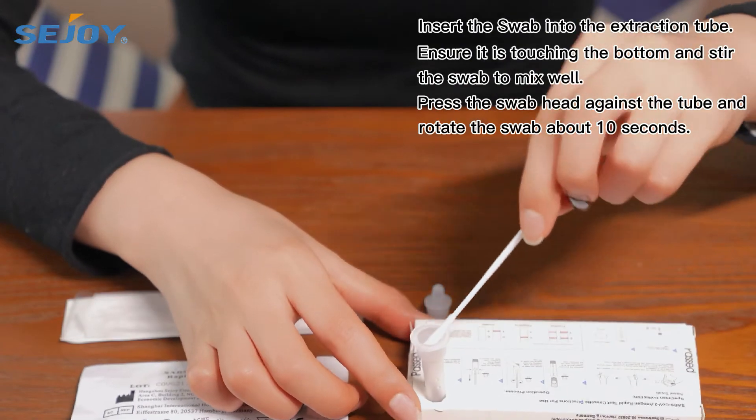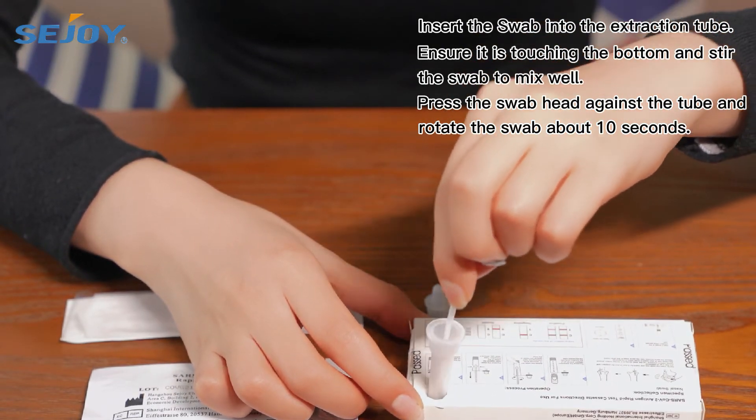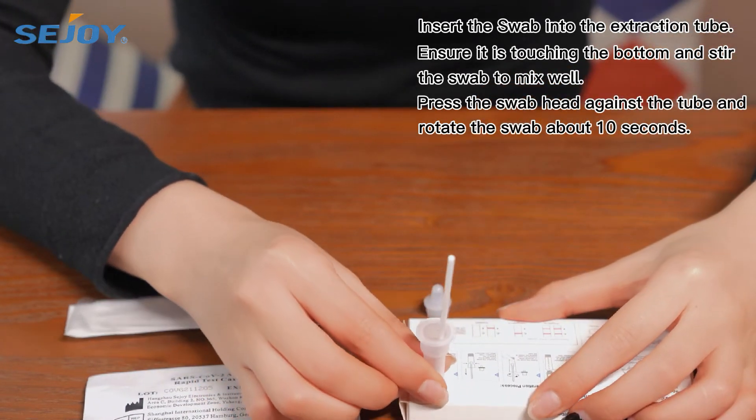Insert the swab into the extraction tube, ensuring it is touching the bottom. Stir the swab to mix well. Press the swab head against the tube and rotate the swab for about 10 seconds.